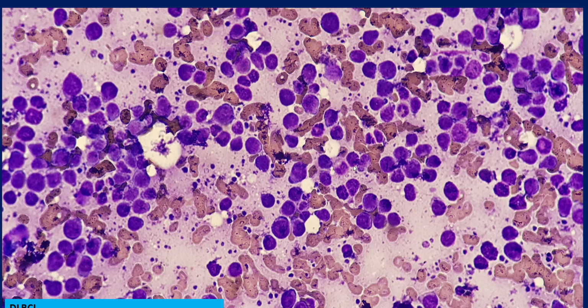This is a diffuse large B-cell lymphoma. No problem here. Large cells, pretty monotonous population. Diffuse large, you do run some immunos, which confirm your diagnosis. It could be any other lymphoma too, but I'm showing you a case which turned out to be a diffuse large B-cell lymphoma on immuno and later on histopathology.